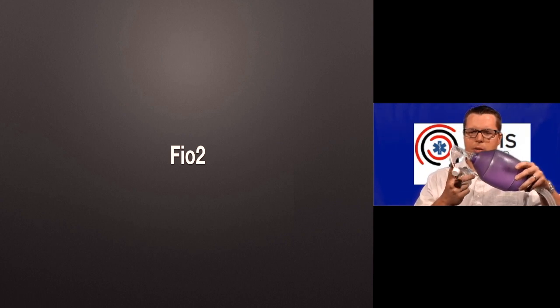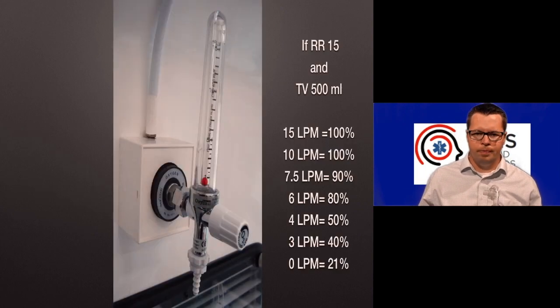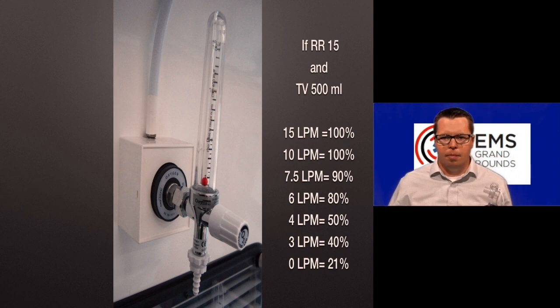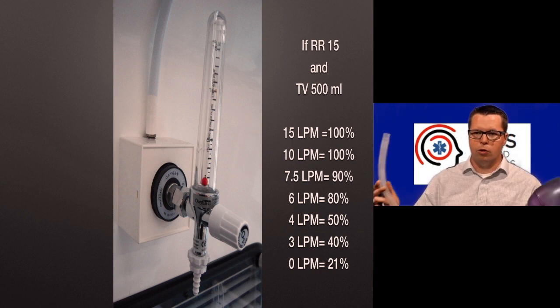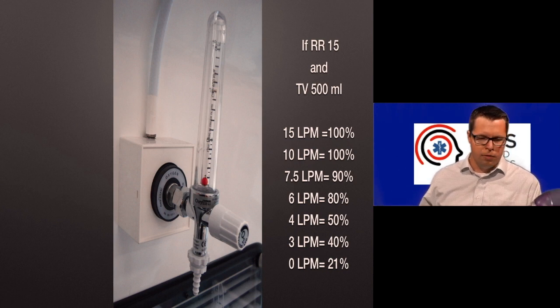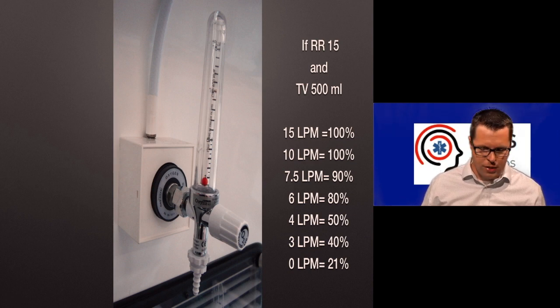Well, you can decrease the amount of gas that is delivered. You can decrease the percent of oxygen that's delivered through this port by changing the flow rate. Go over to the oxygen regulator on the wall, and usually, again, we're going to put this up at 15 or 25 or up at the top, basically on as hard as it can. If we decrease the amount of oxygen that flows through there, then oxygen will instead be preferentially drawn through this tube in the back. And you would get an FiO2 of somewhere between 100% and 21%, depending on how much oxygen, pure oxygen, is actually flowing.